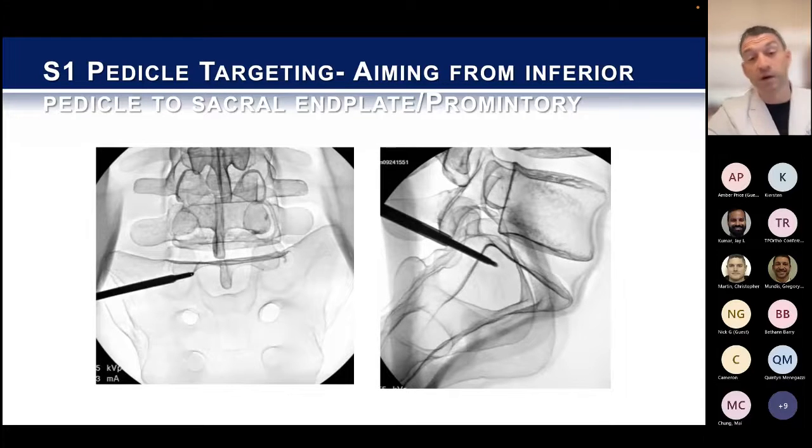It's possible to do bicortical screws in the percutaneous environment as well. Although, it's got to come with its share of risk. So I use that cautiously, but you would basically just breach it on the lateral and then place the screw over the wire. You just have to be careful because that wire will want to migrate anteriorly into the abdomen.